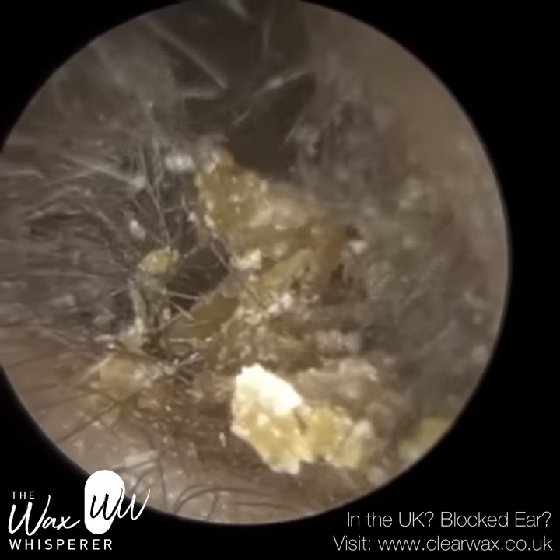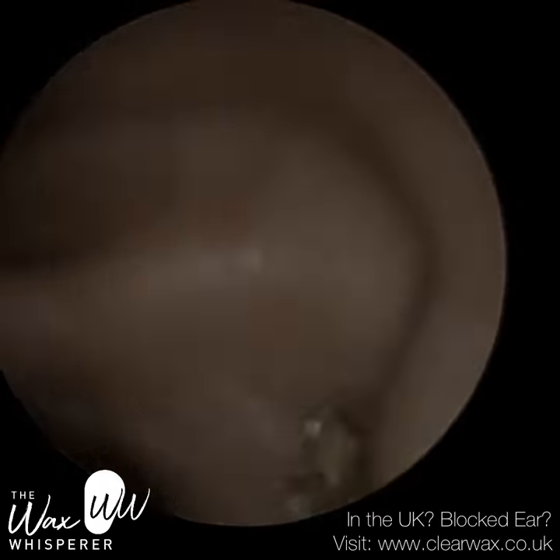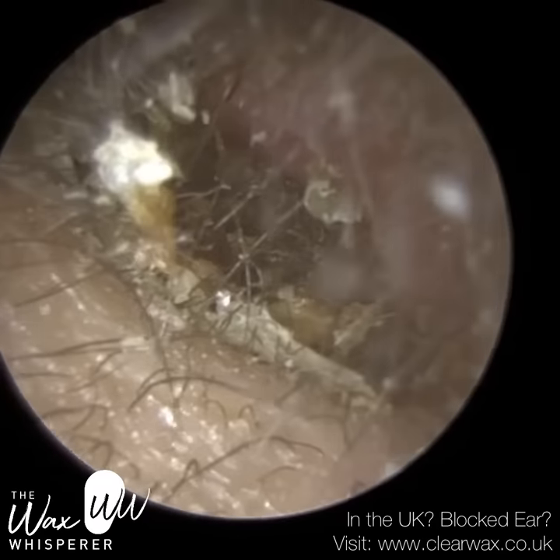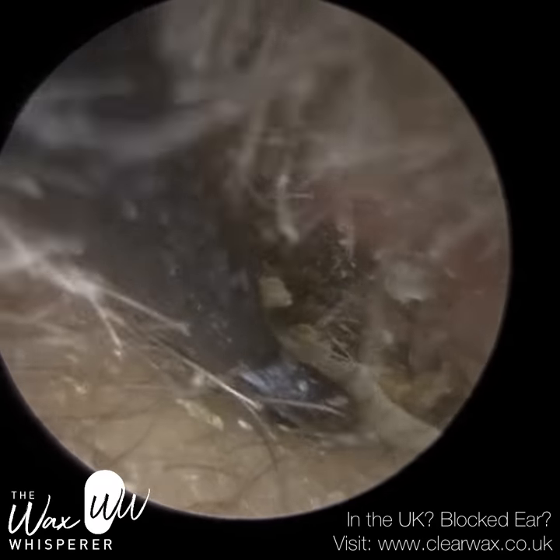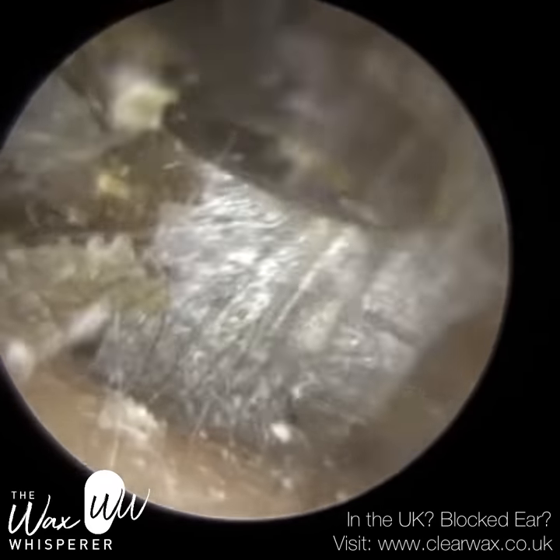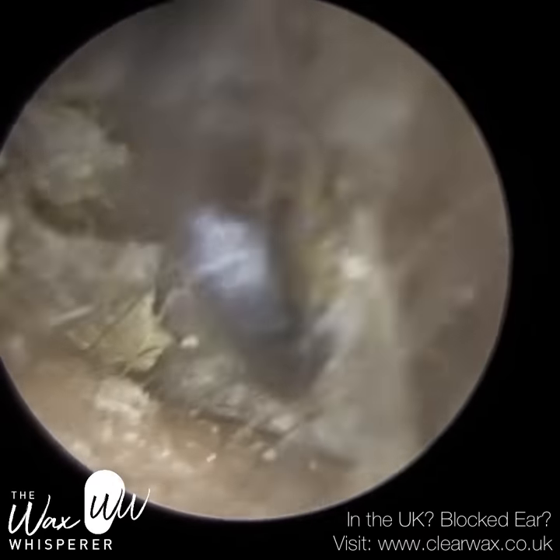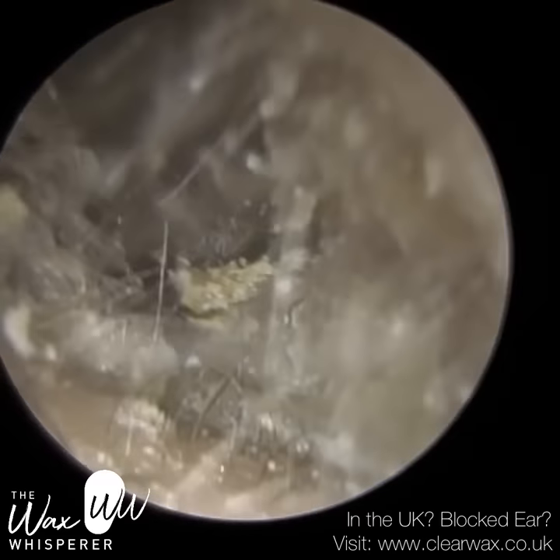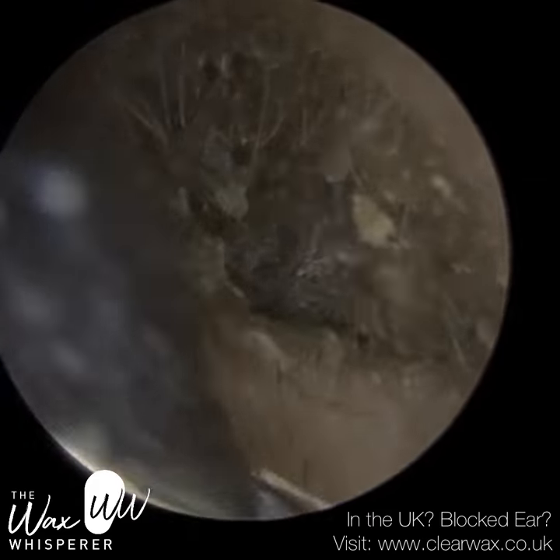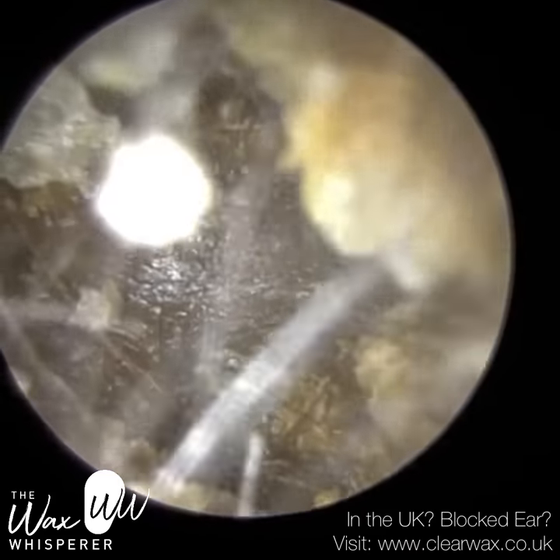Hence why I was querying with the patient if they did trim their ear hairs. I'm now using the Jobson horn, and we've removed the outer half of the ear wax. All this wax is now on the bony part of the ear canal — everything beyond the second bend is the bony portion, and everything in front of it is the cartilage portion. Whenever we're approaching the bony part of the ear canal, we're going to be even more cautious, because it's a much more sensitive region than the cartilage portion.